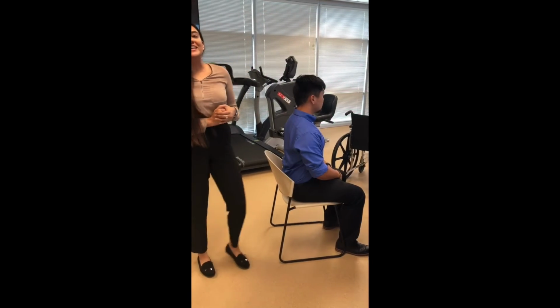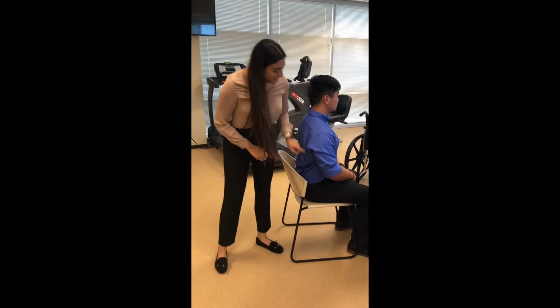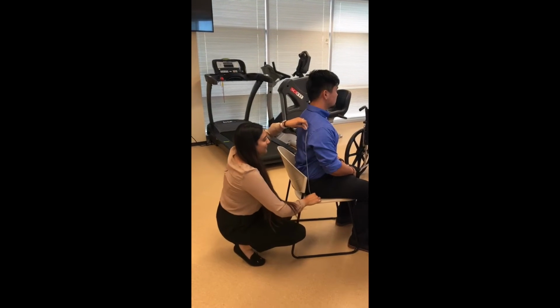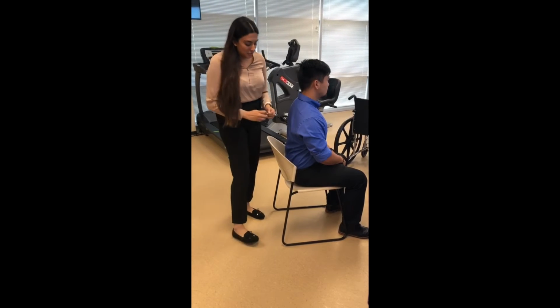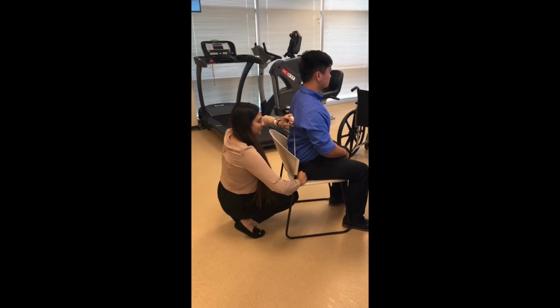Alright, so next we're going to measure the seat back height. So that is going to be from the seating surface up to the axilla. Another way to measure a seat back height is to do it from the seating surface up to the inferior angle of the scapula.